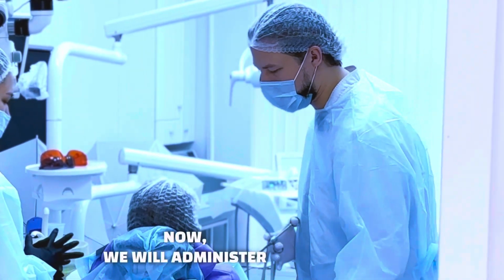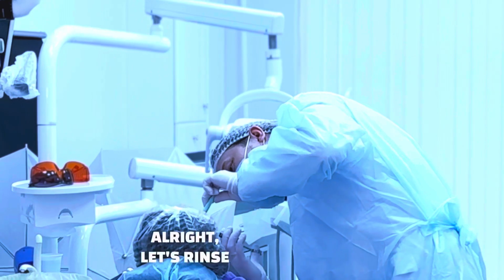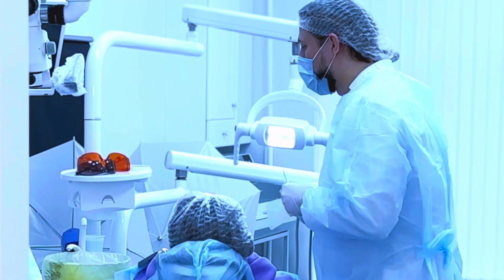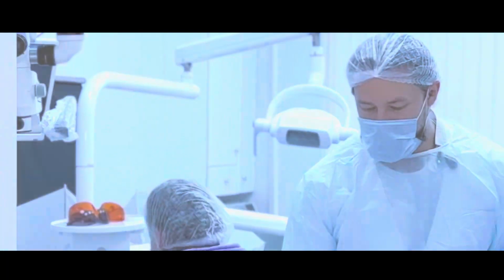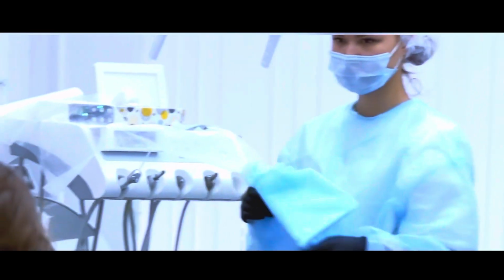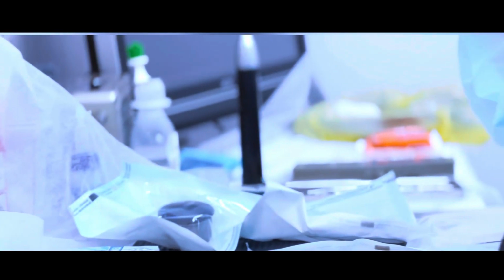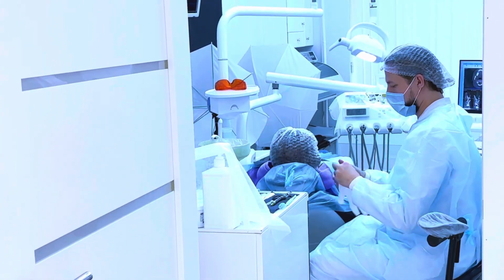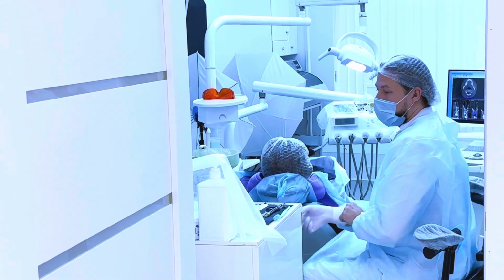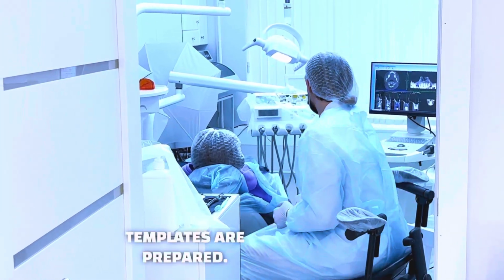Now we will administer local anesthesia. All right, let's rinse and wait a moment. Let me test the fit of the template. It's situated perfectly in the oral cavity. The surgical templates are prepared.